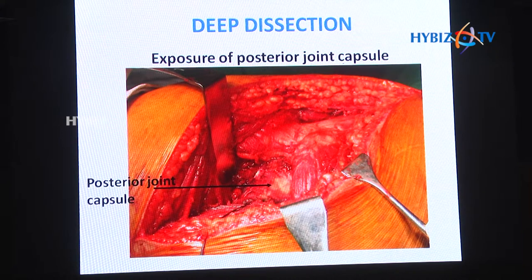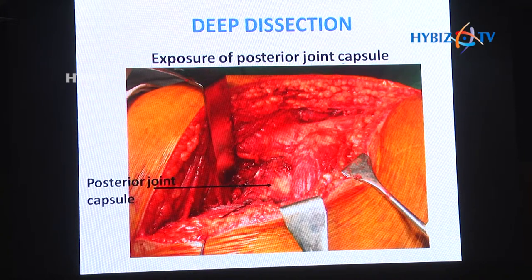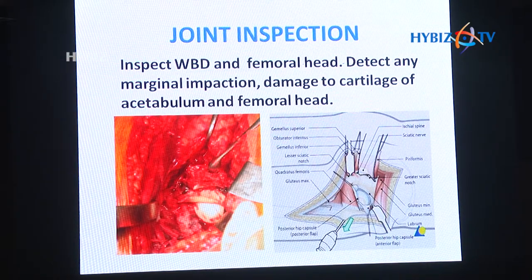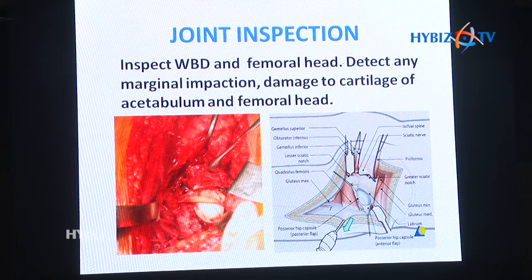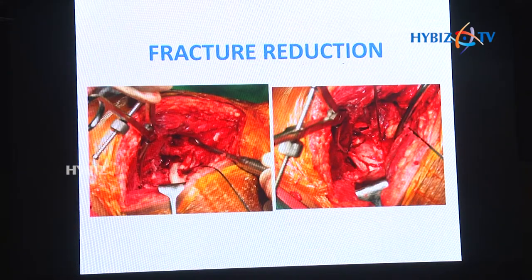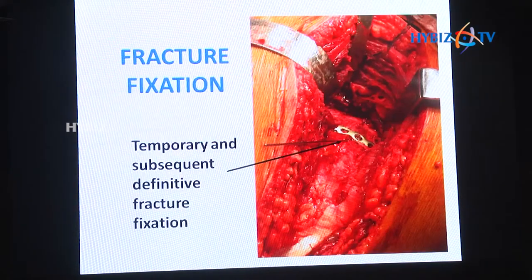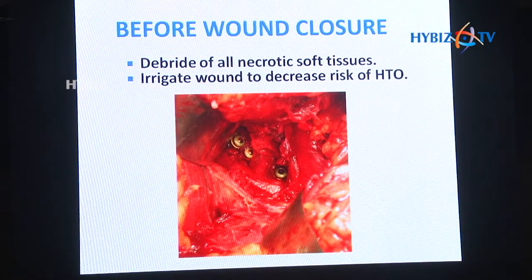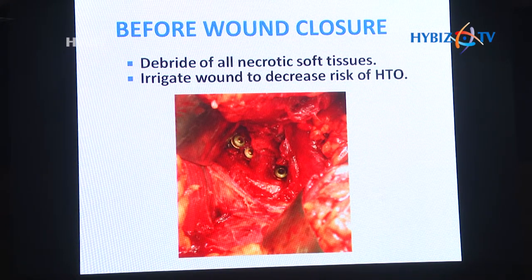Expose the posterior joint capsule — do not cut this capsule because most posterior wall fragments are attached to it. Try to go through the fracture site to see the joint. Debride the joint, examine all the fragments, check for marginal impaction, damage to the cartilage of the femoral head, and try to repair that. Localize, remove, clean, and reinsert any free intra-articular fracture fragments. Fracture reduction can be done with K-wires, spikes, or reduction clamps for temporary fixation, then place a plate over the posterior wall fragments. Remember to debride all devitalized tissues, otherwise the chances of heterotopic ossification are maximum.